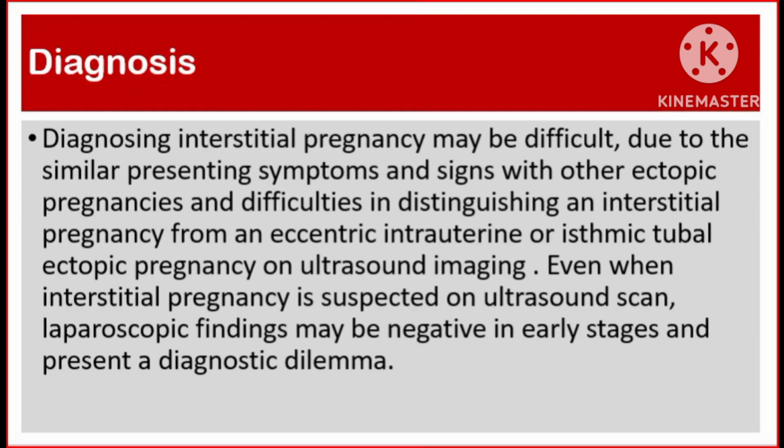Diagnosis: diagnosing interstitial pregnancy may be difficult due to the similar presenting symptoms and signs with other ectopic pregnancies and difficulties in distinguishing an interstitial pregnancy from an eccentric intrauterine or isthmic tubal ectopic pregnancy on ultrasound imaging. Even when interstitial pregnancy is suspected on ultrasound scan, laparoscopic findings may be negative in early stages and present a diagnostic dilemma.